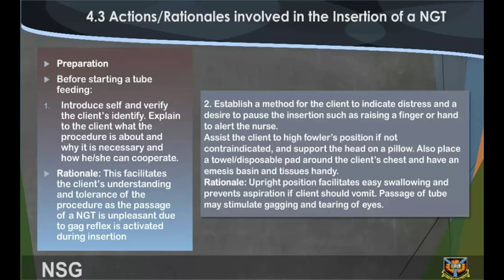understanding and tolerance of the procedure, as the passage of an NGT is unpleasant due to gag reflex being activated during insertion. 2. Establish a method for the client to indicate distress and a desire to pause the insertion, such as raising a finger or hand to alert the nurse.